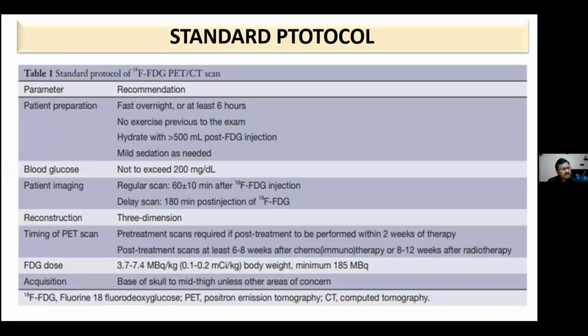Patient imaging, generally we scan the patient. This is actually a universal slide, but we take the scan around 45 minutes to 1 hour. A delayed scan may be required. In that case, we take the delayed scan at 1 hour to 1.5 hours after the initial scan. Reconstruction is 3-dimensional. We have a 3-dimensional image.